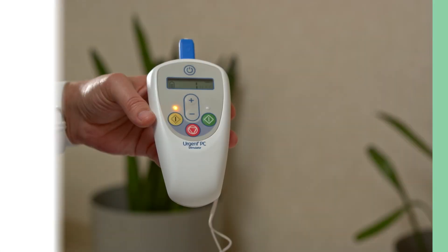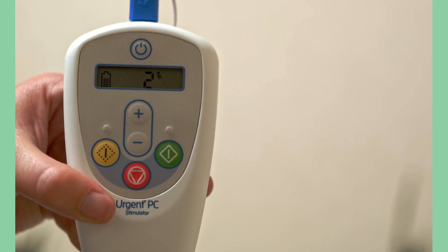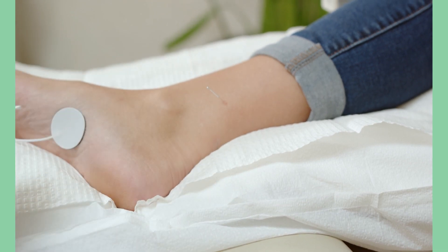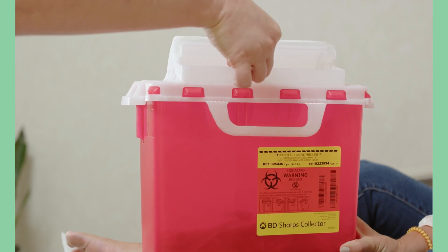Once the appropriate therapy level is identified, press and hold the green therapy button for two seconds. Therapy mode begins and is automatically set for 30 minutes. The treatment level may be increased or decreased at any time. However, if you turn off the stimulator once it's in therapy mode, you will need a new lead set. When the treatment is complete, the stimulator will display the word 'end' and emit a series of three beeps. Turn off the stimulator and remove the needle electrode and other components. Discard as appropriate. Remember that the patient's treatment level will vary based on depth and treatment, so patients shouldn't think they're receiving less effective treatment if their number is four one time and nine the next.